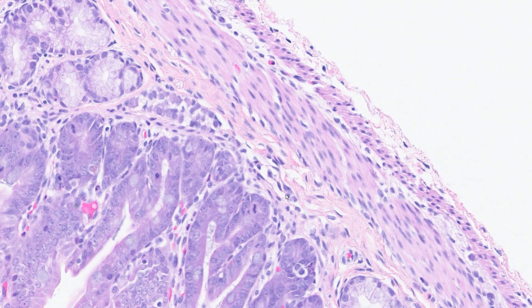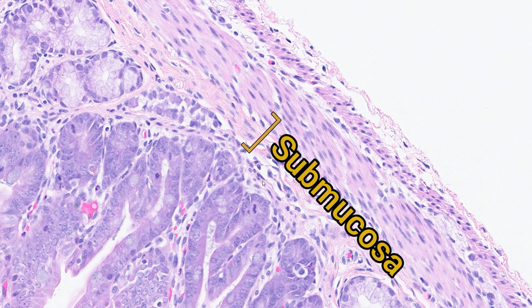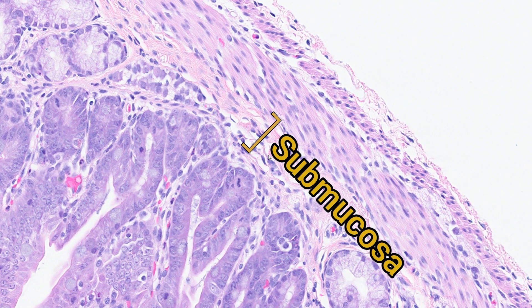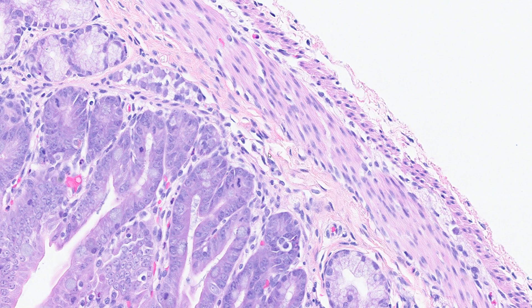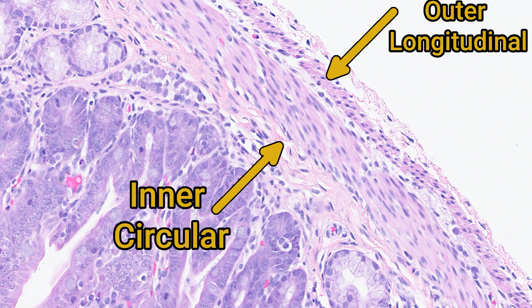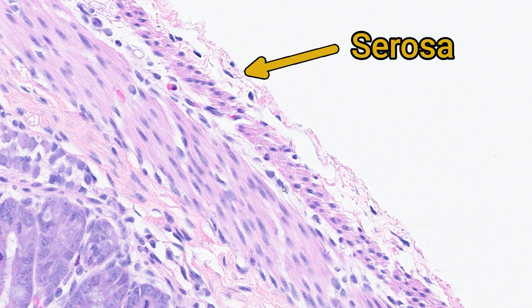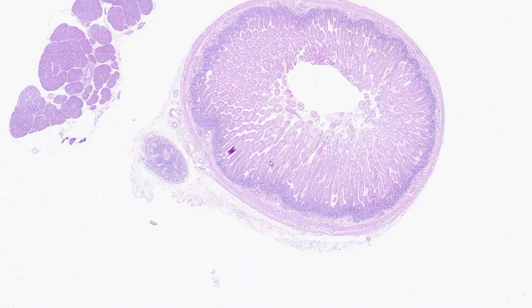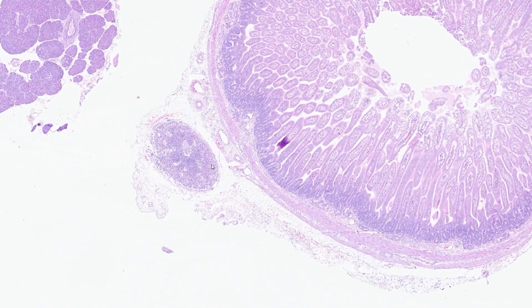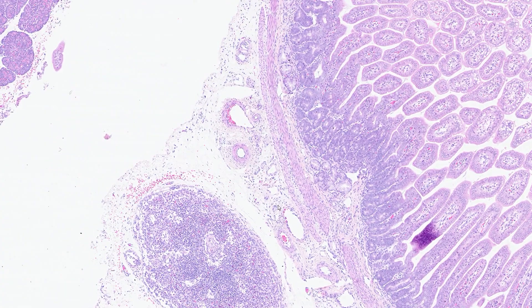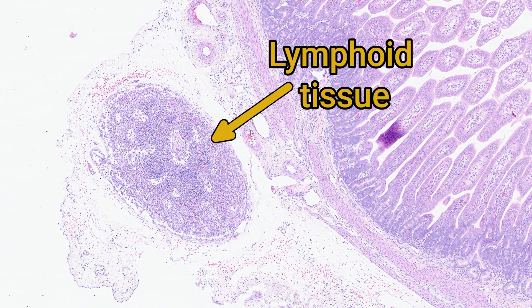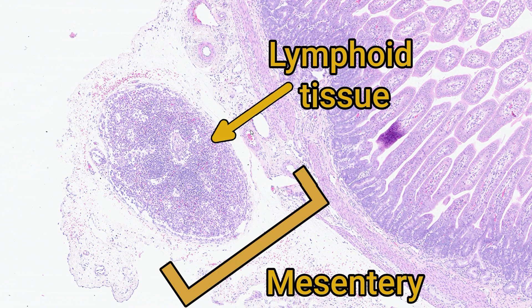All the connective tissue below the muscularis mucosa is the submucosa, where you'll find larger blood vessels, lymphatics, nerves, and ganglia. Next are the two layers of the muscularis externa: an inner circular layer and an outer longitudinal layer. Finally, the outermost layer is the serosa, composed of connective tissue and a mesothelial lining. Often at one border of the intestine you'll find the serosa expanded by larger blood vessels, lymphoid tissue, and adipose tissue — this is the mesentery, the connective tissue that suspends the intestine within the abdominal cavity.